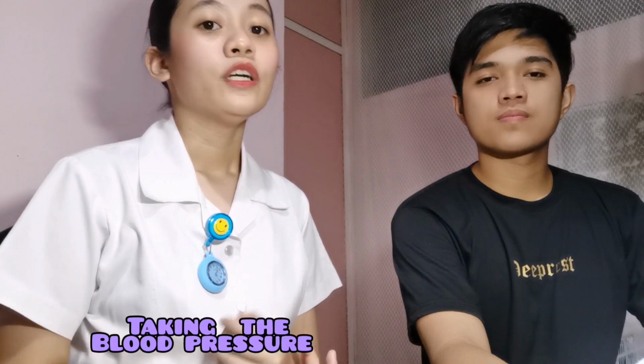After taking the pulse rate and the respiratory rate, we will now go into taking the blood pressure. Loosen the clothing up to the axilla because the clothing interferes with the ability to hear the Korotkoff sounds, which could result in an inaccurate blood pressure reading.